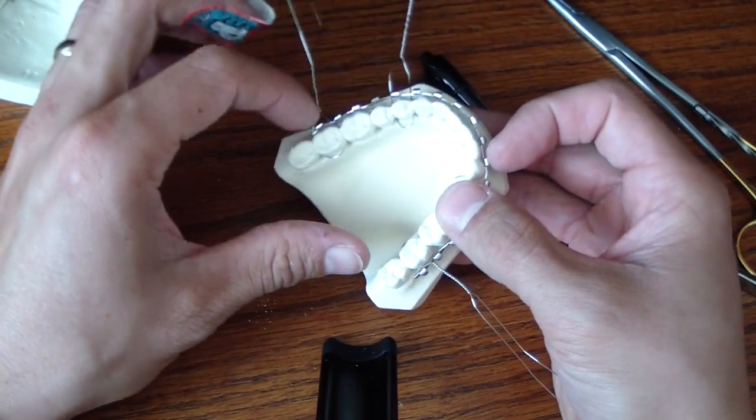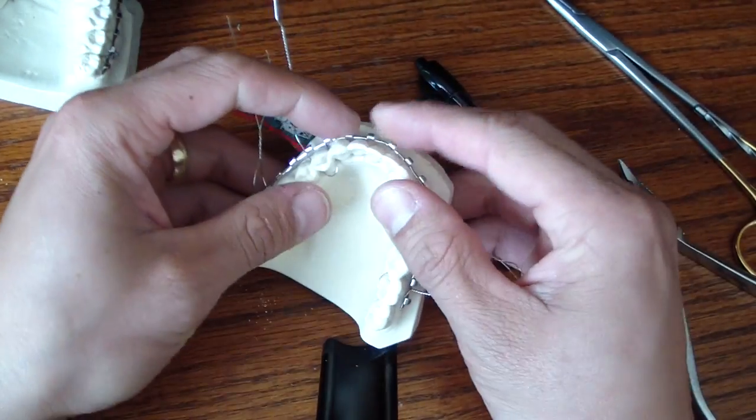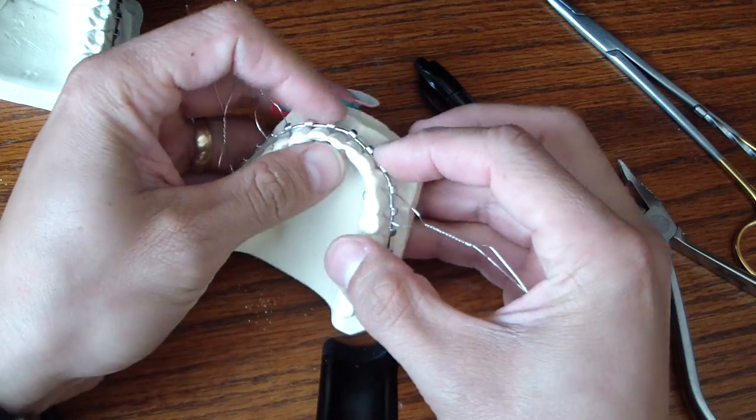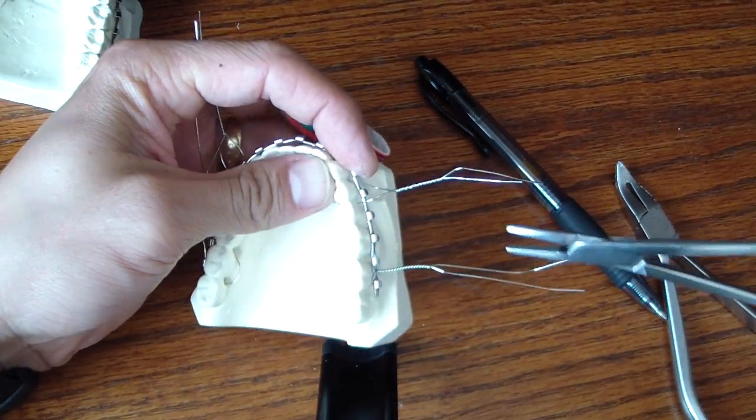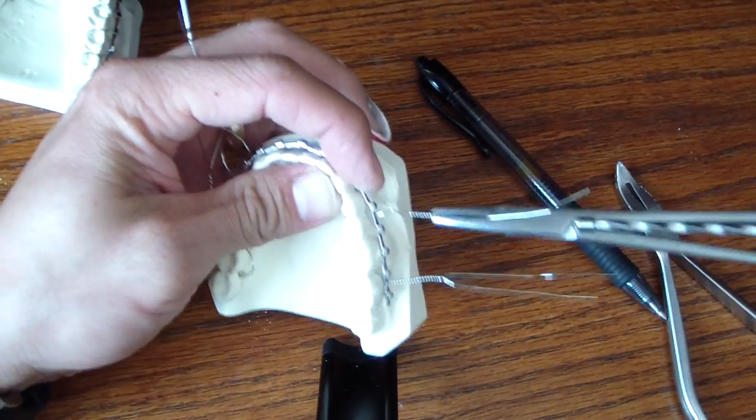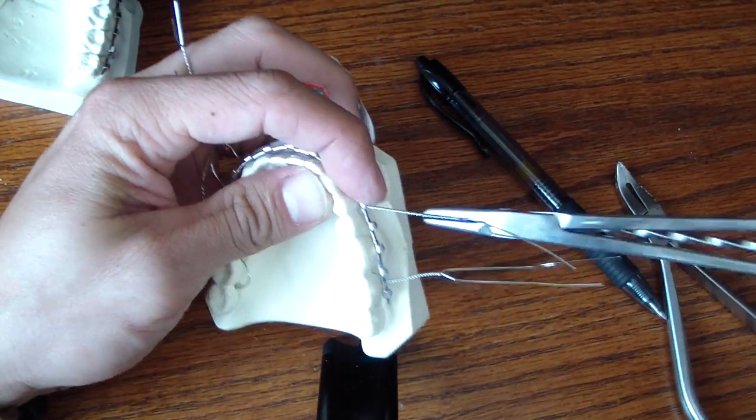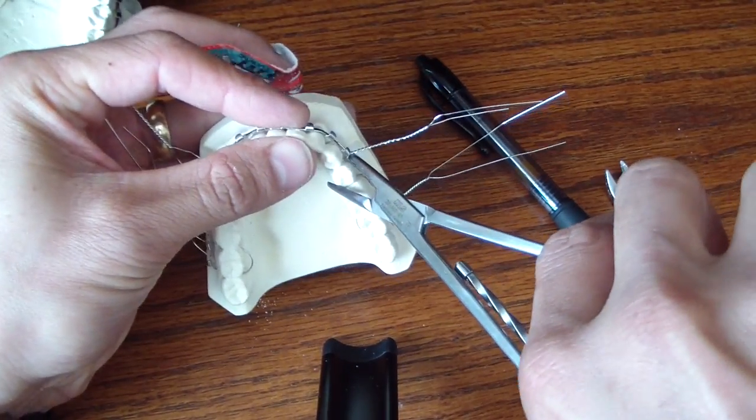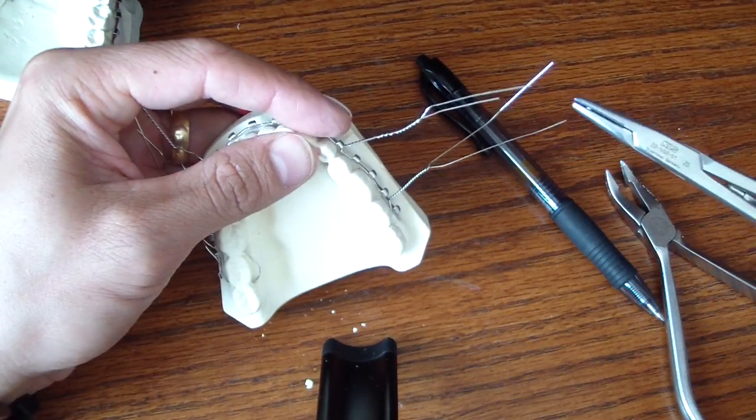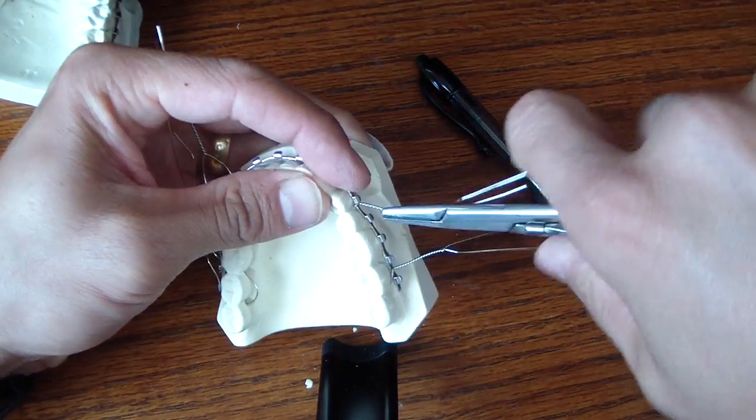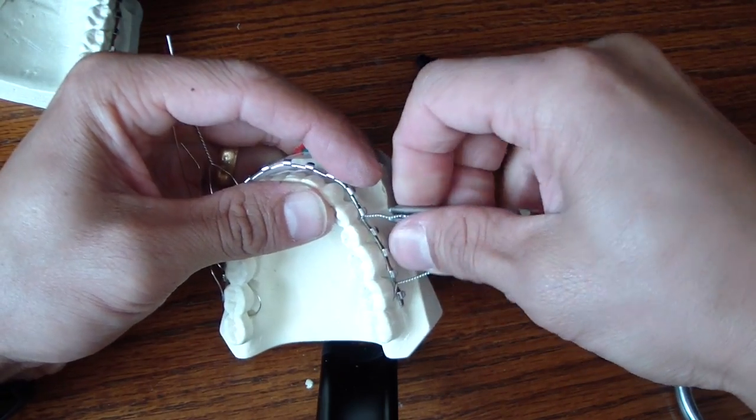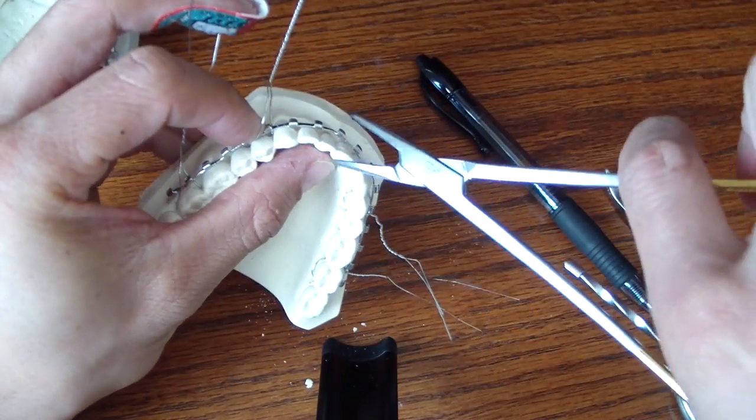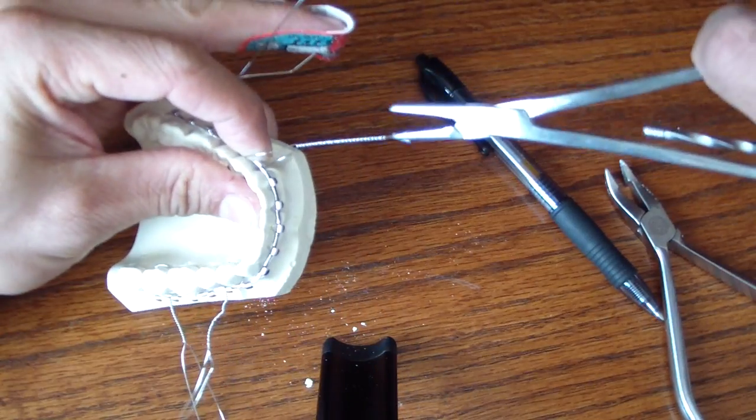You can either go front to back, anterior to posterior, or all the way around. But the last thing you want is to tighten this, tighten it at the posterior, tighten the other side, and then this is all loose with nowhere to put it. We've got these speed forceps. We try to adapt this also. I can't find regular Hagar forceps around the house. Don't break the wire. We're just going all the way around making sure it's nicely adapted. You can do this on a cast, tough to do that intraorally.